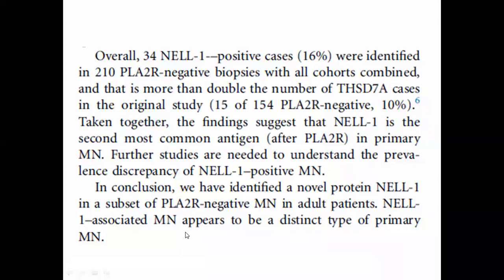Is it possible to have PLA2R negative and IgG3 predominance? Yes. When you say IgG3 predominance, either you say only IgG3 is there, so it is only the IgG3 channel. If PLA2R and thrombospondin are negative, and I see IgG3 only, I will look carefully at kappa lambda, because mostly IgG3 dominant disease or IgG3 only staining is seen with MGN with dysproteinemia. In cases of proliferative GN with monoclonal immunoglobulin deposits, or PGNMID, IgG3 is the most common immunoglobulin which is positive. So if you see IgG3 predominance or only IgG3 staining, I would consider it, especially if it is an elderly patient. But I must say age is also not a criterion. I've seen a 35-year-old male with MGN with dysproteinemia.